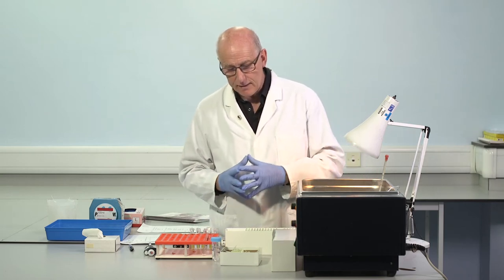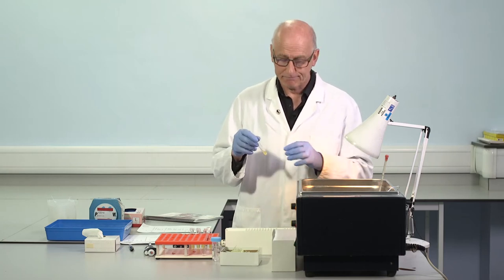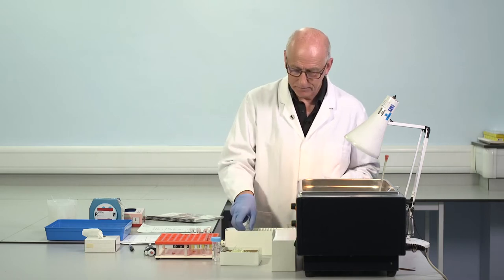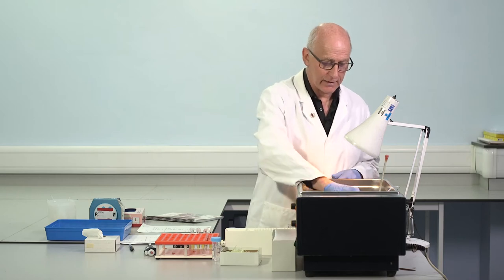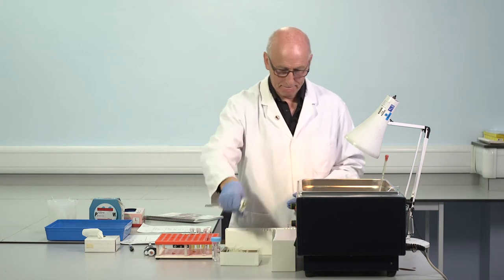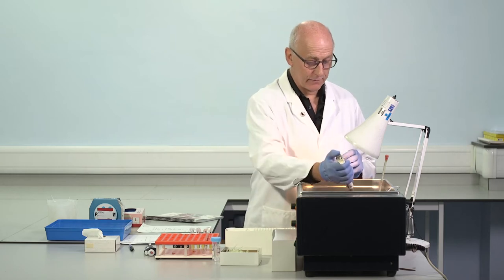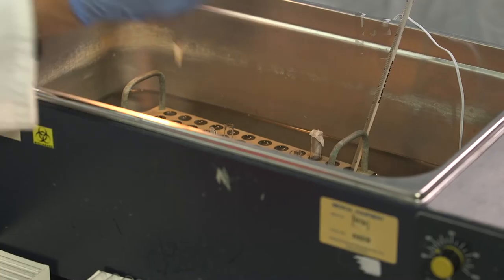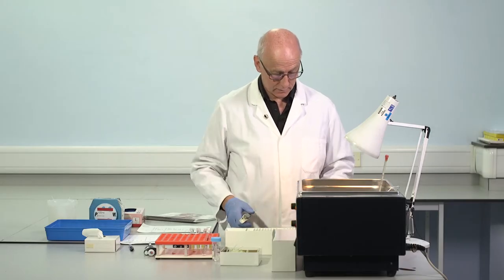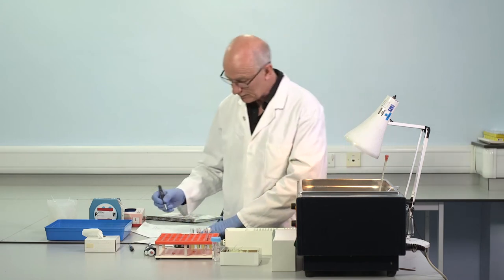So we've got a series of test samples. So number one is a sample from a patient. And we'll run an APTT with the same reagent on this sample. So once again, duplicate tests, two glass tubes, fresh pipette tip. Hundred microliters of patient sample into each of the two glass tubes. That's for the two replicates. I need to record the control value, 44.